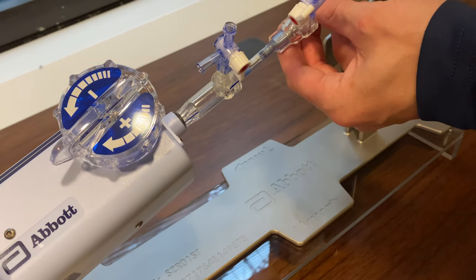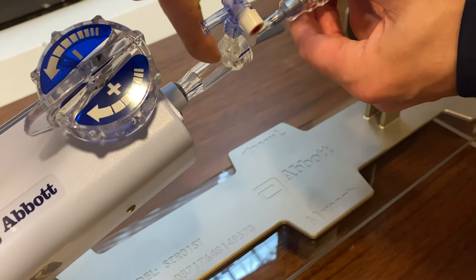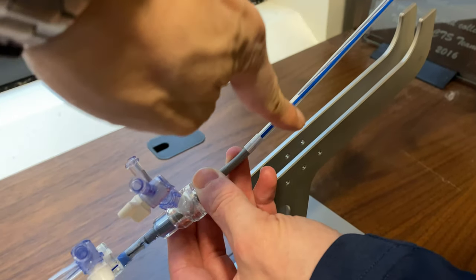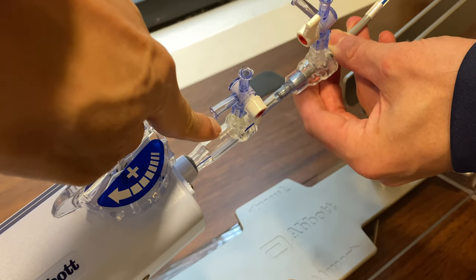This demonstration shows the clip insertion into the guide. You can see that there's a blue line here, and there's also a blue line here. These two have to be aligned to make sure that it's properly keyed.